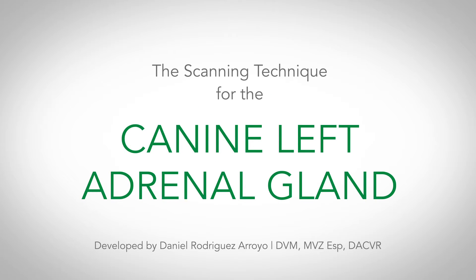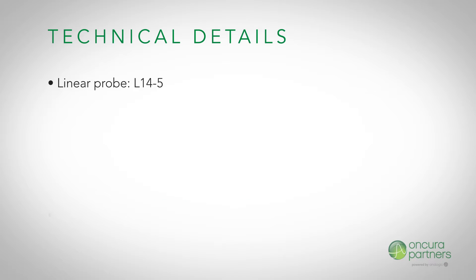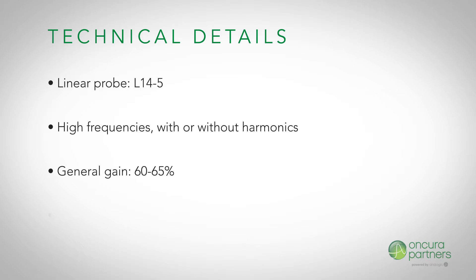This video covers the scanning technique for the left adrenal gland in lateral recumbent canine patients. A linear transducer will be used at high frequencies, with or without harmonics. The general gain should be maintained at approximately 60 to 65 percent, and the third or fourth TGC curve should be selected from the drop-down menu.